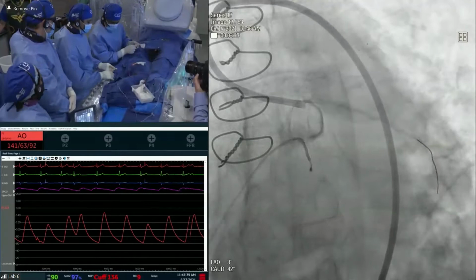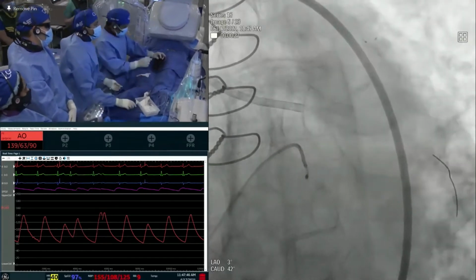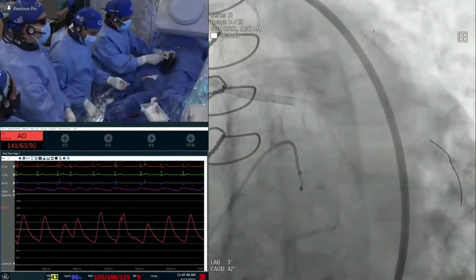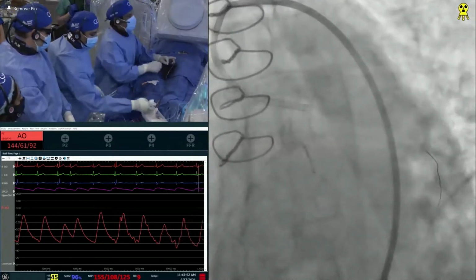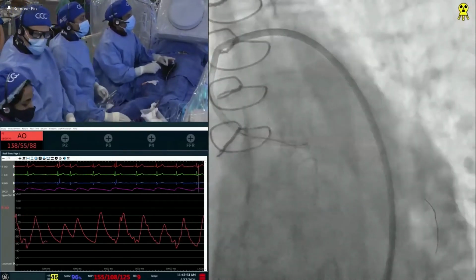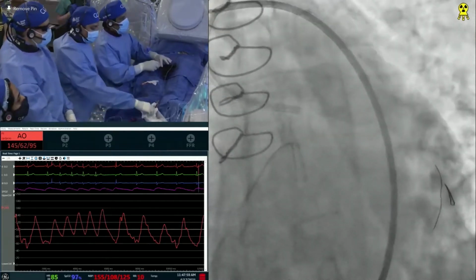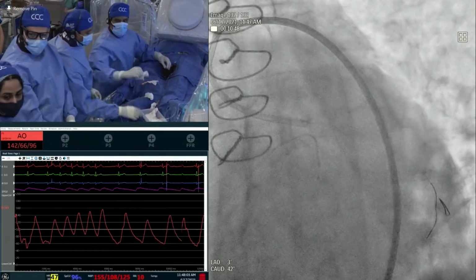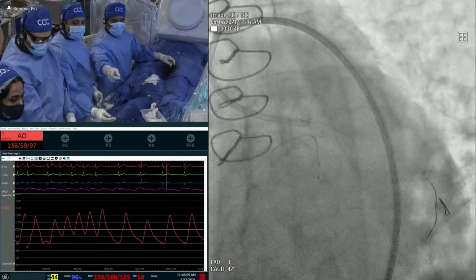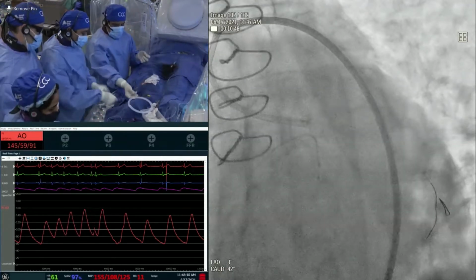Because remember, even if you go and magnify, you see it was just that area. Now actually you see a little bit of expansion, although people say maybe it's imagination, but most of the time I don't think that the rotablation ablates the stent. What it does basically is heat it up. Your subsequent balloon dilatation will then expand. Now we are 4.0 NC ready. I am still going to leave the rota wire just to get that extra mileage.